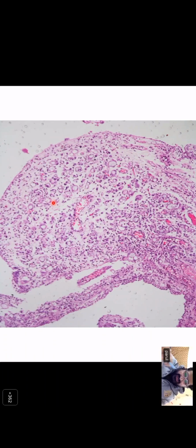On 26th, sir, we were talking about this slide only, and some of the people were saying that these are capillaries. I agree, these are capillaries. But I said on that day that it looks to me like signet ring cell change. Very good. Because if we clearly see these things, there is plenty of mucin inside them, there is some mucinous kind of material, and the nucleus is pushed to one corner of the cell, an eccentrically placed nucleus. Obviously we will never see mucin in any of the capillaries. Very good. Perfect.